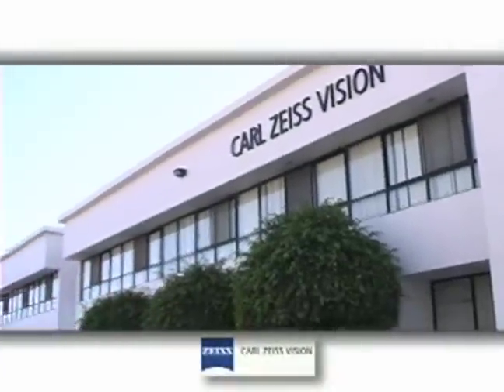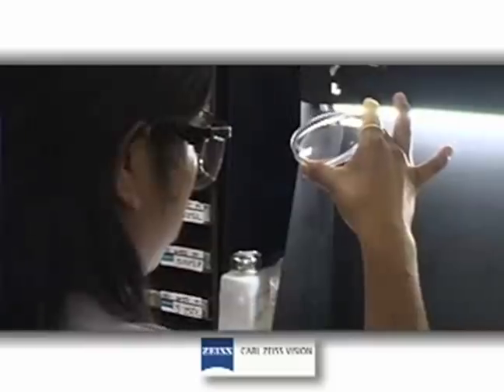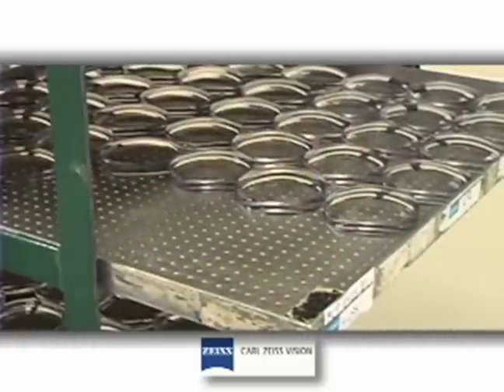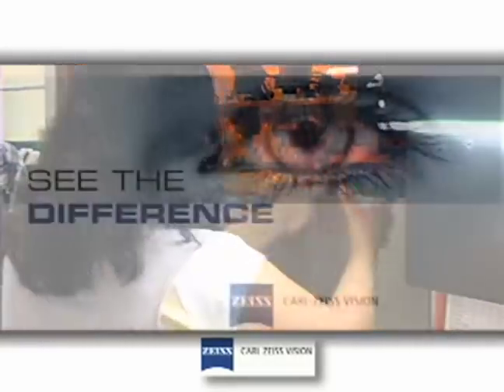The purpose of this video is for all Carl Zeiss Vision worldwide inspectors to adopt a common practice in lens inspection, to ultimately deliver good quality lenses to our customers worldwide, and to standardize the way we inspect lenses within all sites using the CZV way.